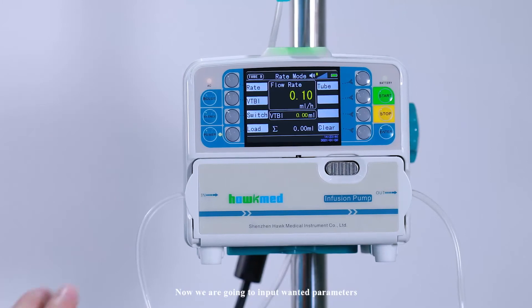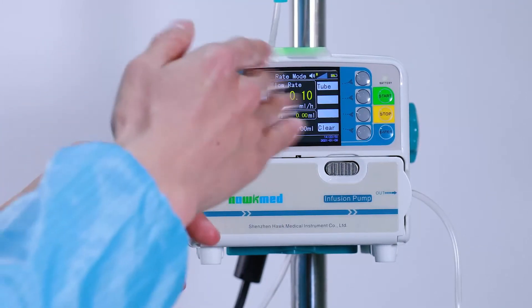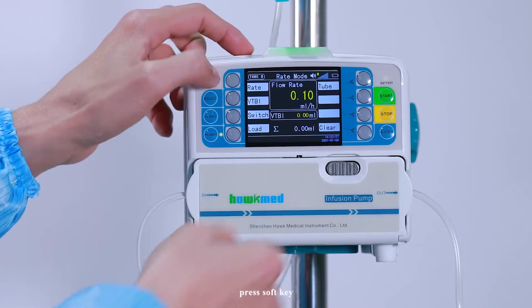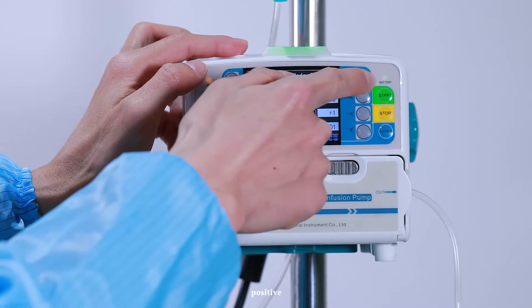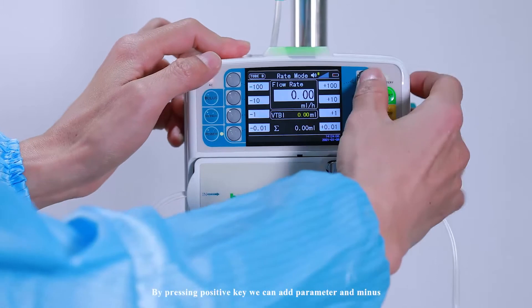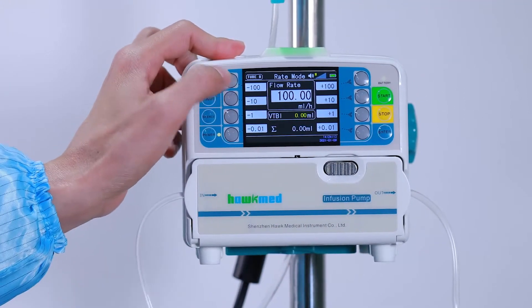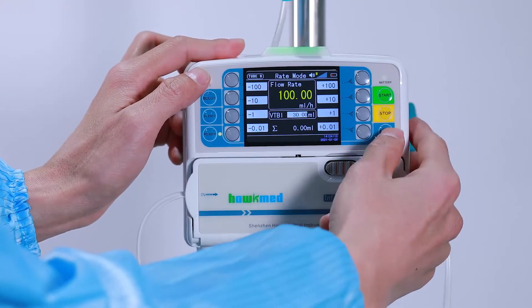Now we're going to input the wanted parameters. We can always use the 8 soft keys. Press the soft key — negative or positive. By pressing the positive key, we can add a parameter, and minus to reduce it. Press Enter, input VTBI, then press Enter.